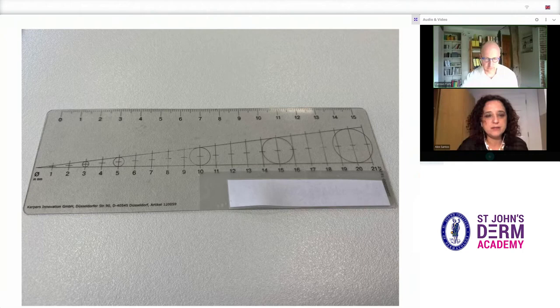And this is a ruler which has been specifically designed for reading skin prick test results, with diameter circles to aid measurement of induced wheals.